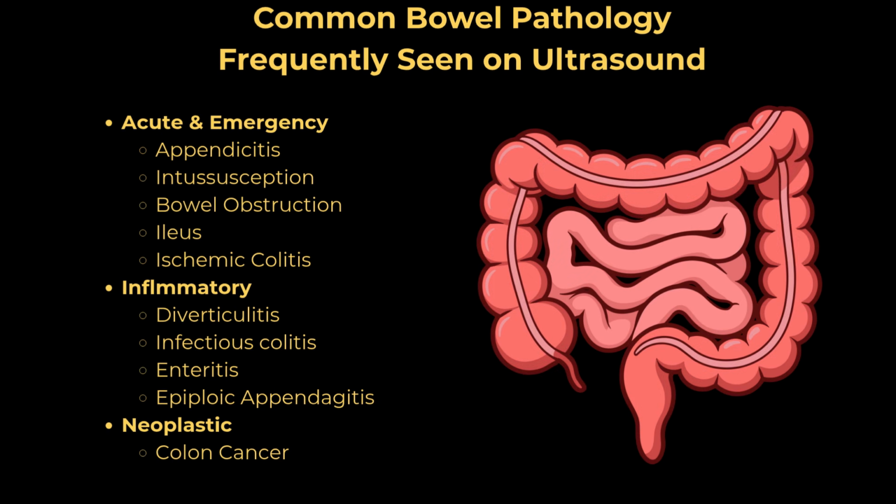These are common bowel pathologies that can be diagnosed with ultrasound. You will see them often in daily practice. Because these conditions are common, learning them will build your confidence. I will explain these pathologies using a simple and practical framework. This makes it easy to approach any abnormal bowel and confirm your findings.